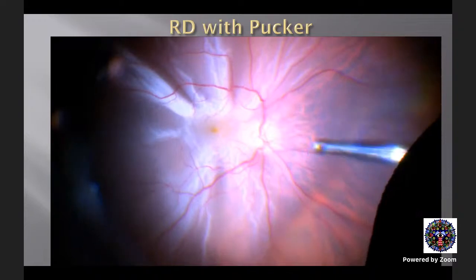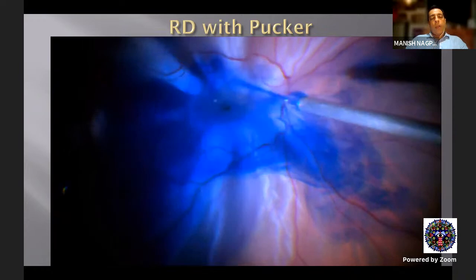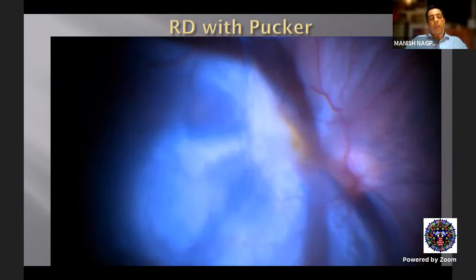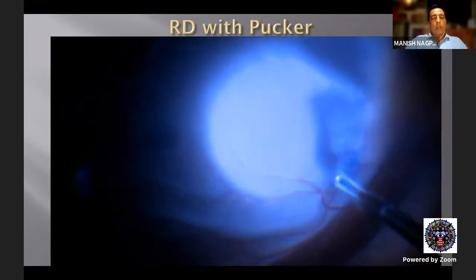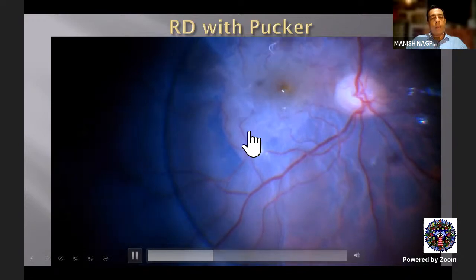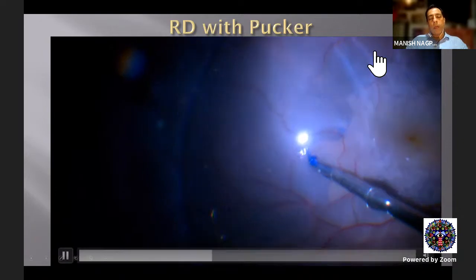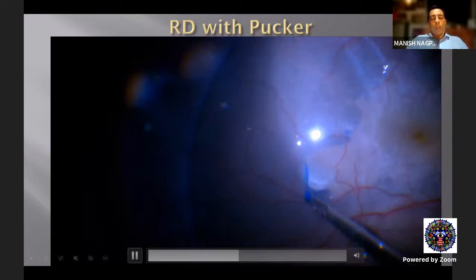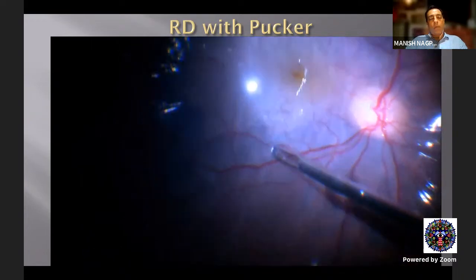Now, this is a case where you don't see a well-formed pucker as you saw in the one before, and so here one would stain and remove the ILM in that area, because very early formation of a membrane or a pucker would be there, even though you don't see it. And when you remove the ILM here, as you can see, once the ILM is removed, I'm flattening it with the PFCL to further expand the diameter of the ILM, because there are radiating folds from there. So once you see PVR changes, you may have to look for these membranes or folds which are there.